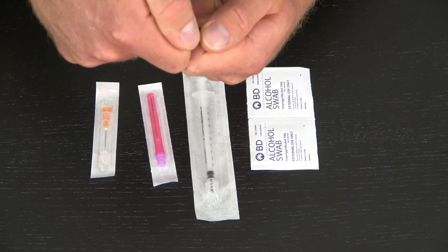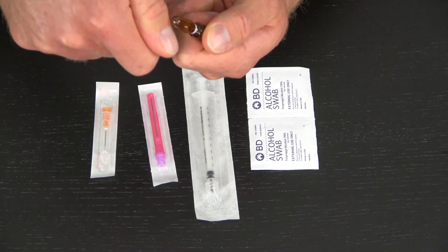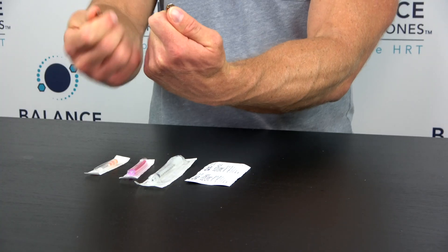You've got to be fairly firm but not too aggressive. You should hear a pop just like that — the top comes off. This is glass, so I just chuck that in my sharps bin.